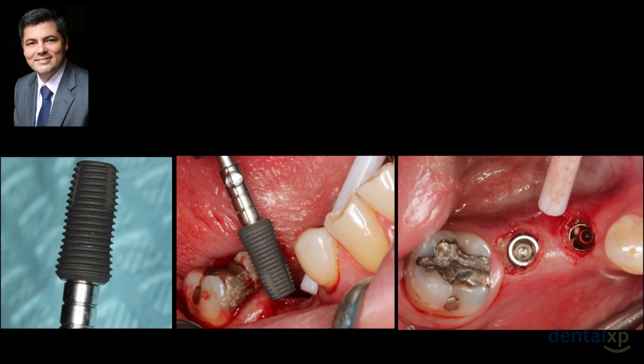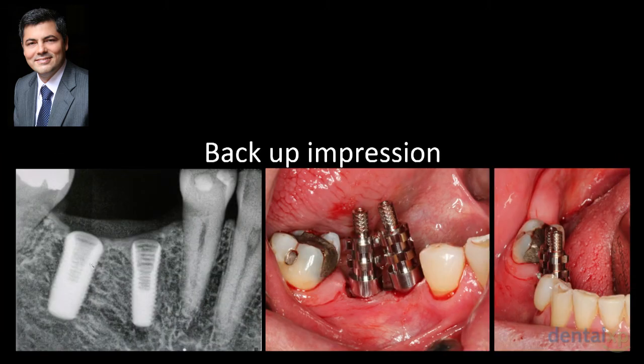These are Chinese implants. This surgery was done out of the country, Chinese implants, because Chinese are getting into the implant market, so beware of what is coming from those guys. These are the actual implants placed. And what you see here is an X-ray right after implant placement, and we always take a backup impression.